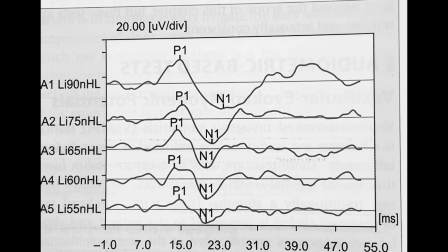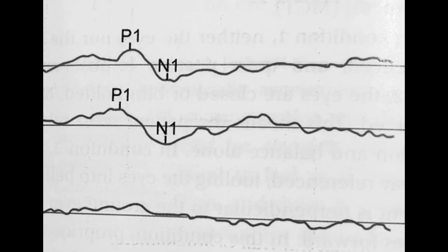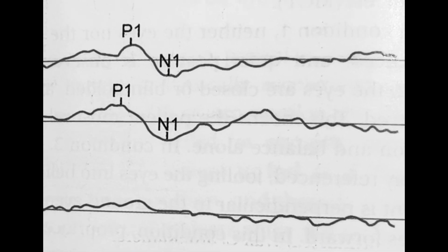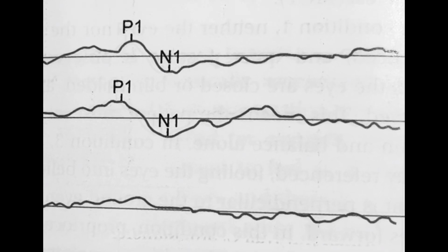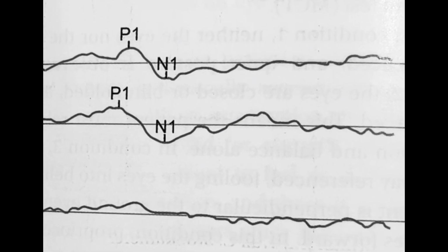These signals are relayed through the medial longitudinal fasciculus, activating the inferior oblique muscle. The response is recorded using electrodes placed near the eye. This test assesses utricular function and the integrity of the superior vestibular nerve.